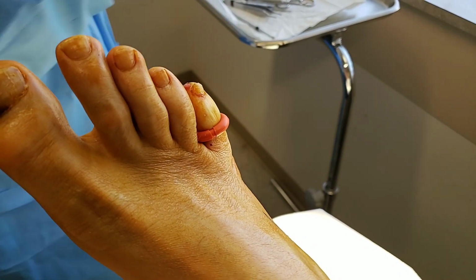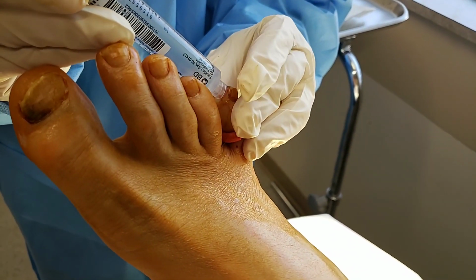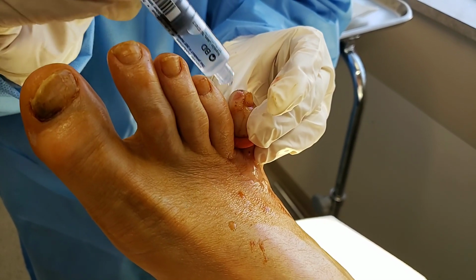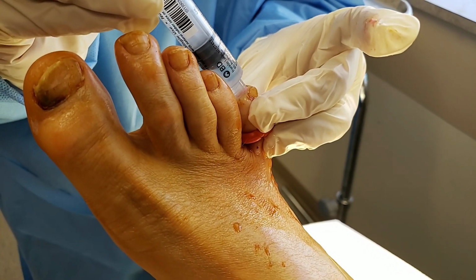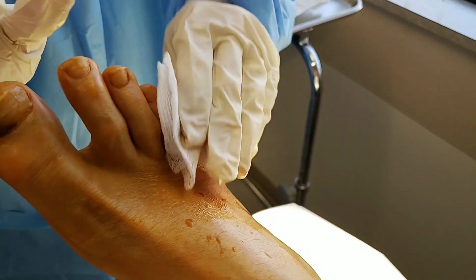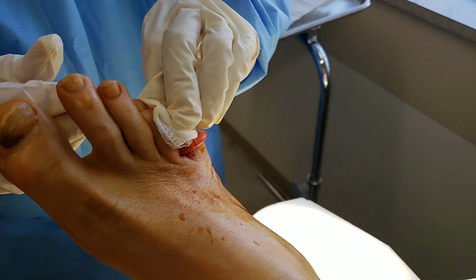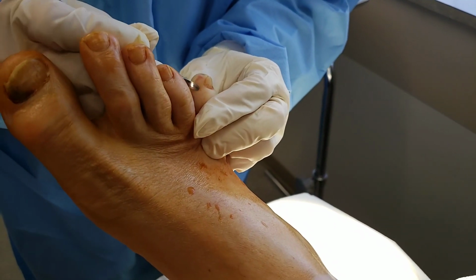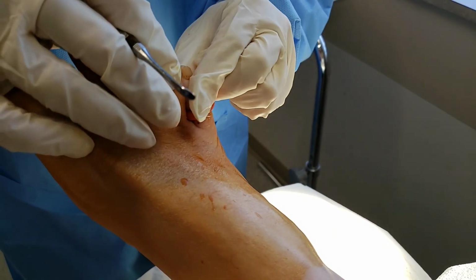Then what I do is I take a little saline and you kind of just try to get out all that stuff that's in there. And then you just check one more time. So it's all nice and soft right in there. So that's going to avoid the toes from rubbing.